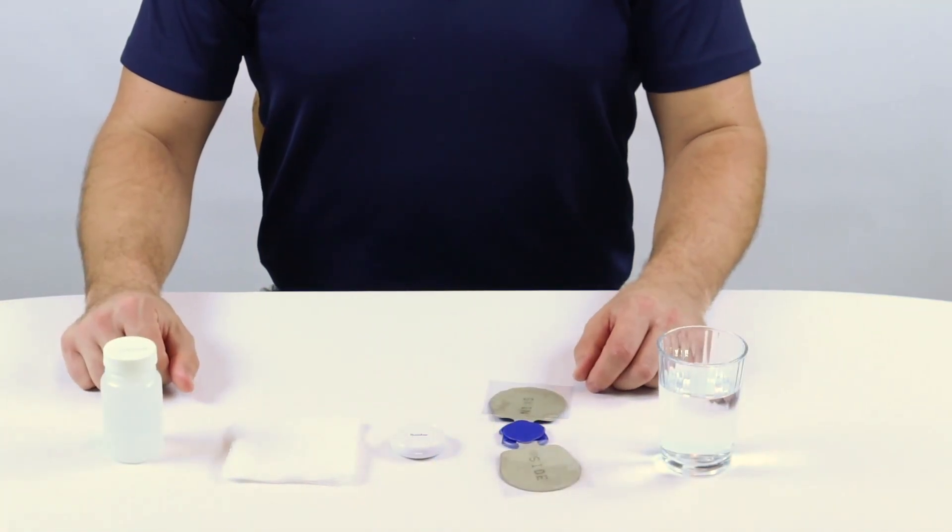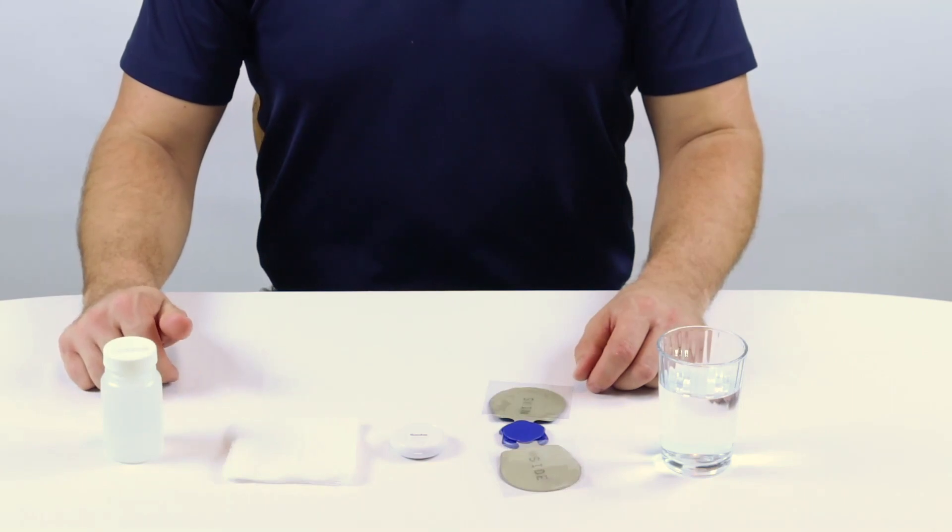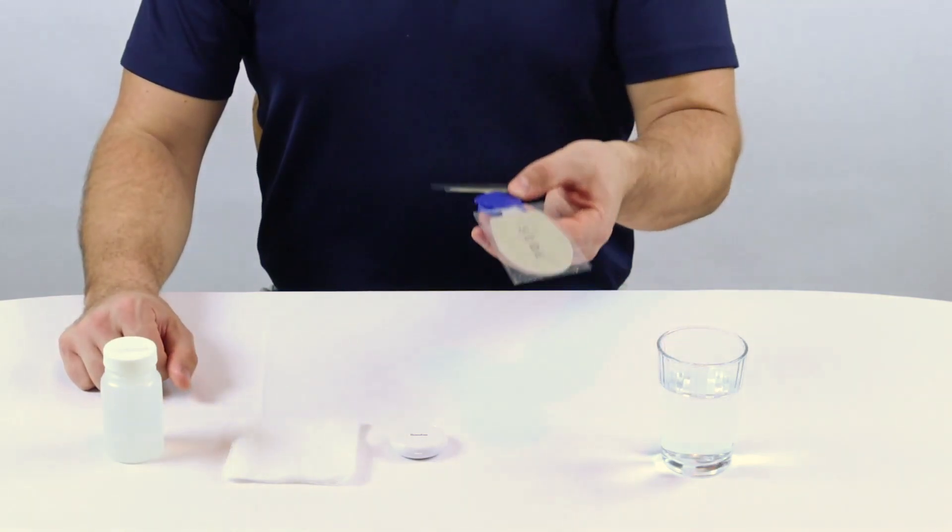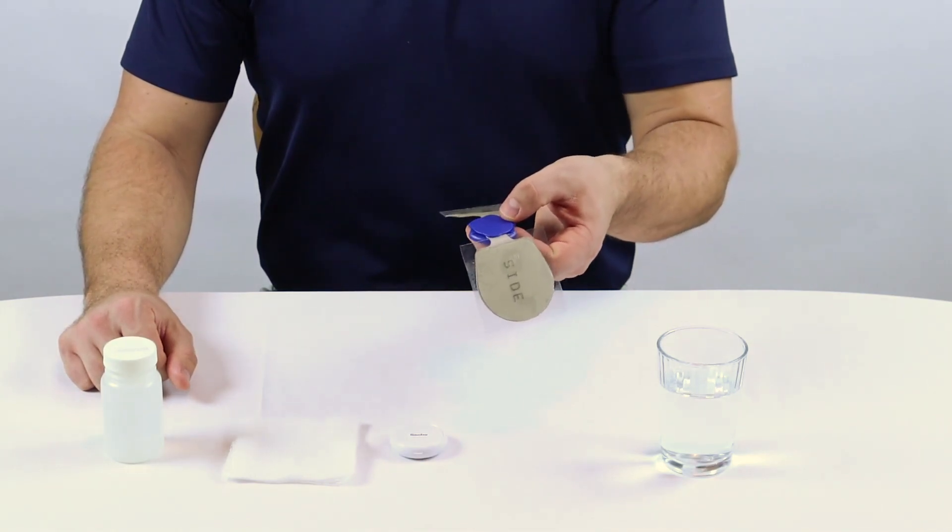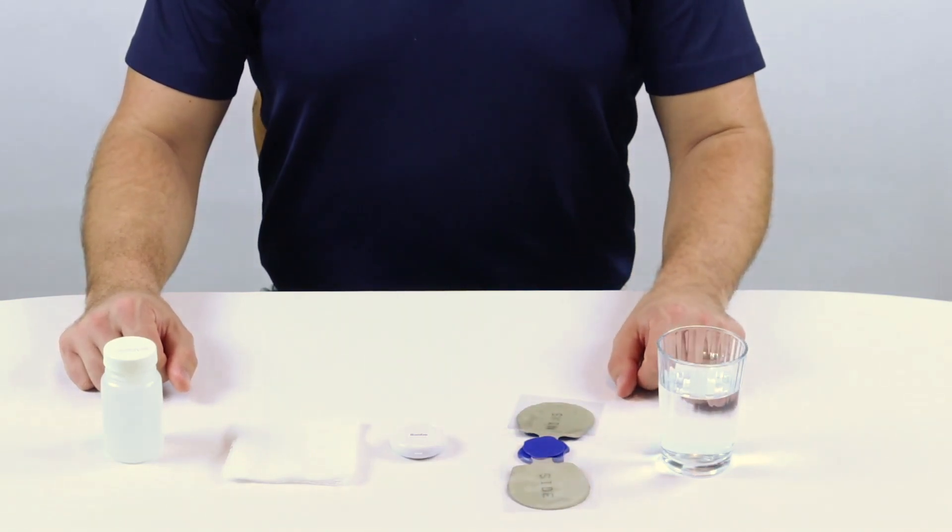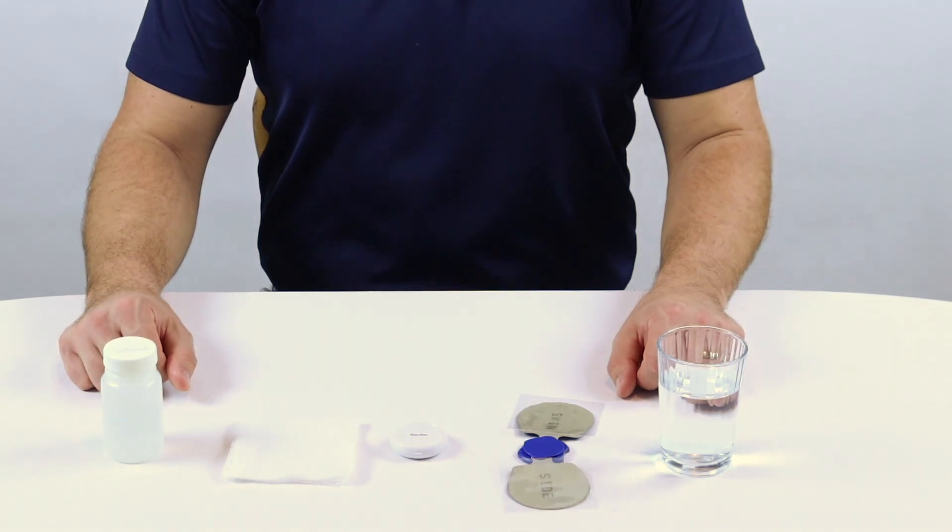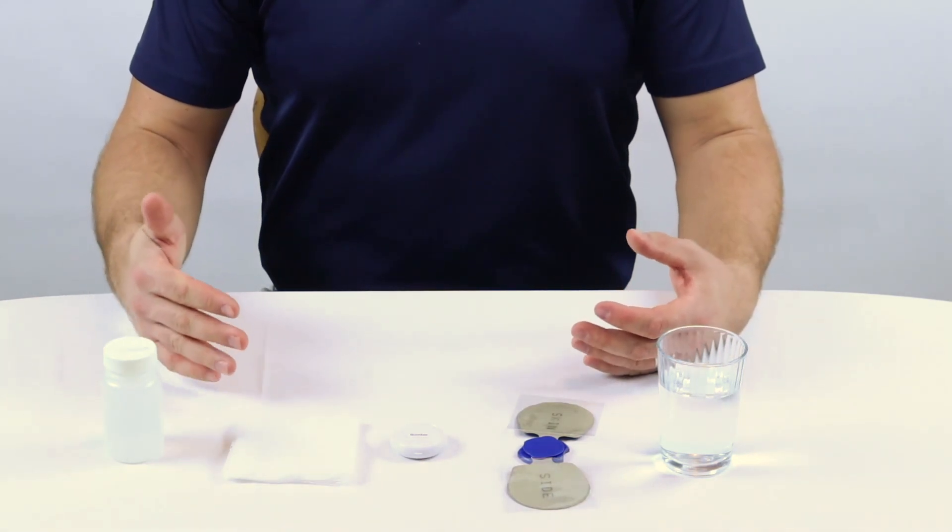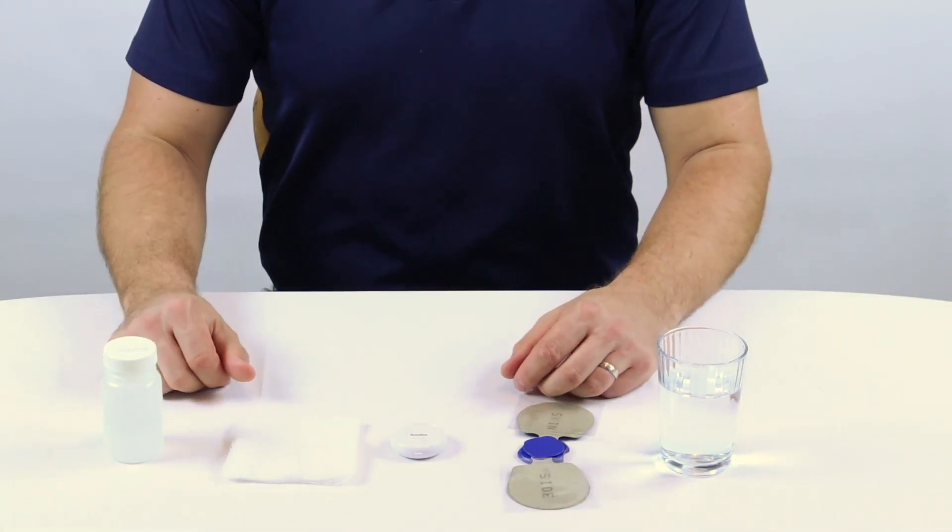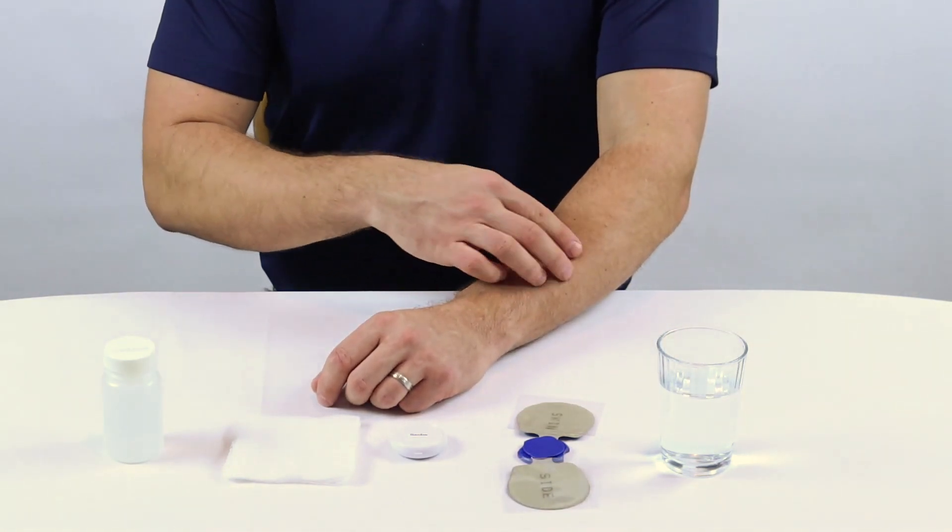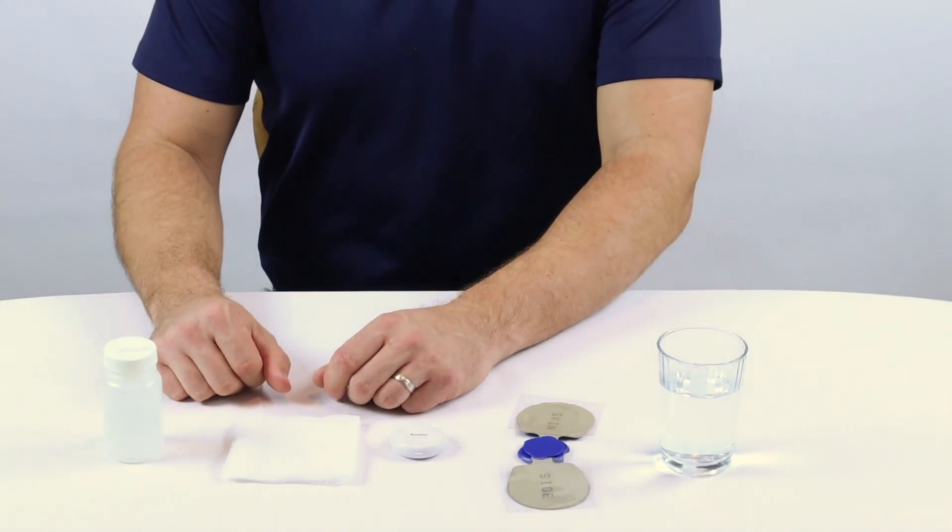Another commonly asked question about the Sabostim Go is, how do I extend the life of my gel pads? Most people can get 10 to 12 uses out of their gel pads, but you need to follow these important steps. Like typical electrical stimulation pads, the gel pads of the Sabostim Go will not work properly if there is lotion, cream, sweat, hair, or dead skin underneath the gel pad. If you have long or thick hair in the area you intend to use the Sabostim Go, then you may need to trim that hair for best use.